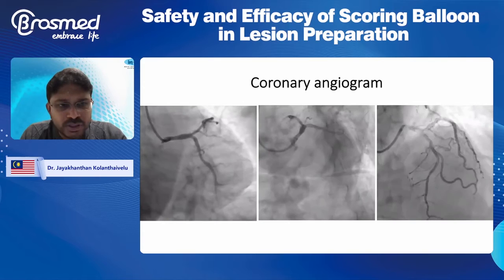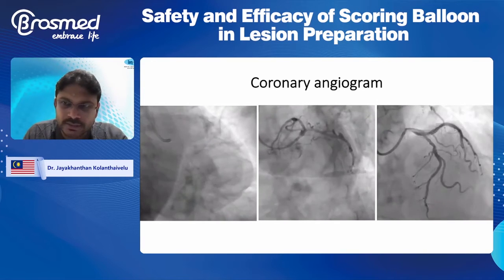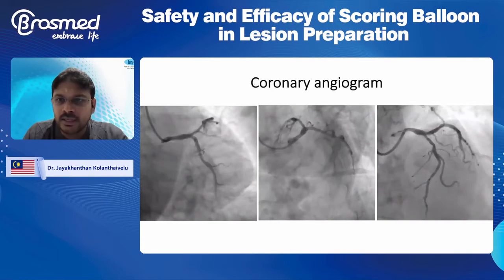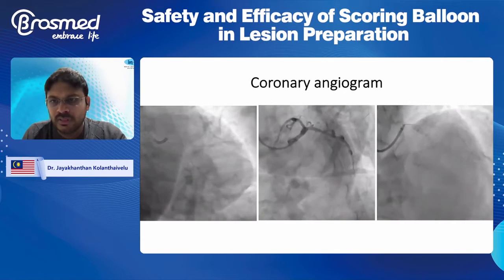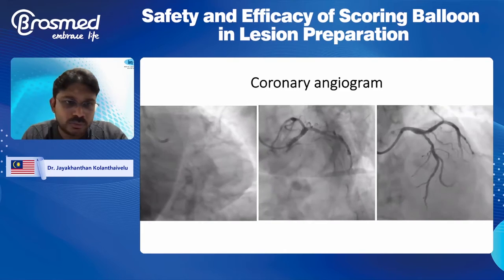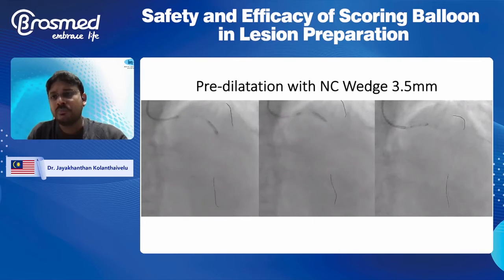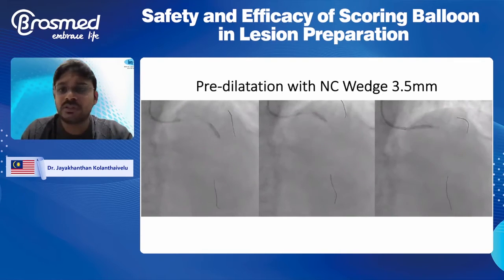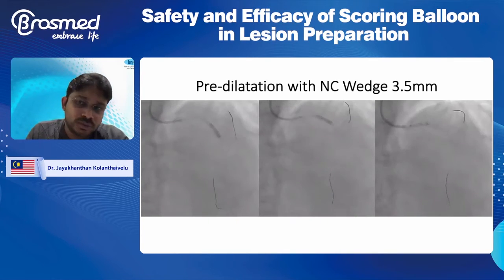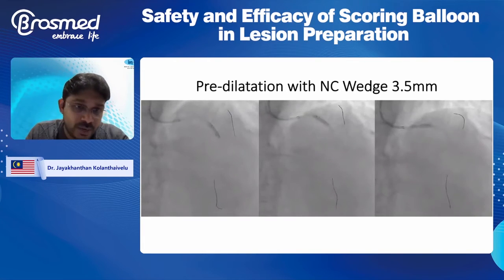And if you can appreciate, there's a little bit of calcification. It's not 360, probably about 90, close to 180. And we were hoping that, because it's a large vessel, we can avoid atherectomy, hopefully with a scoring balloon too. So that's what we did. Because we put in an IVUS, we knew the size of the vessel was huge, 4.0 in the LAD and 4.50 in the left main.